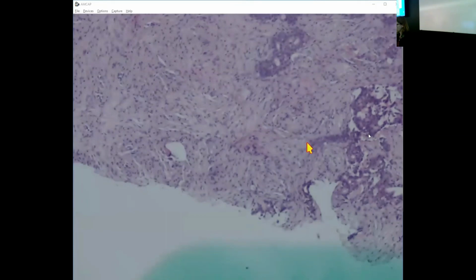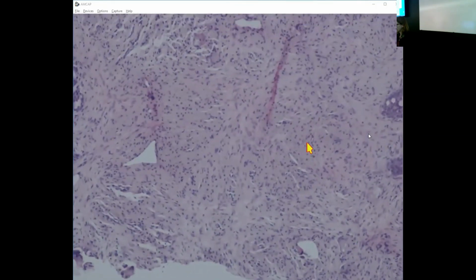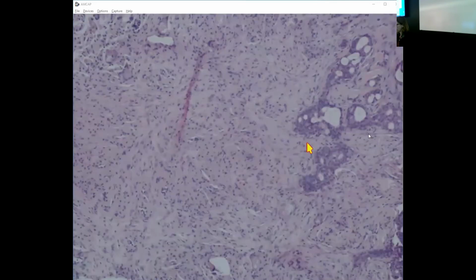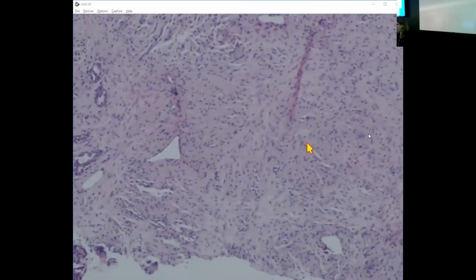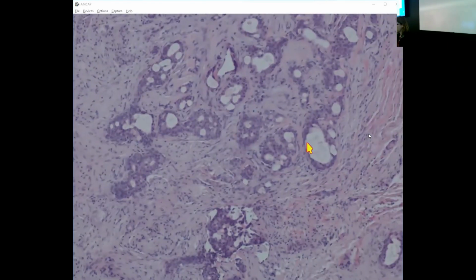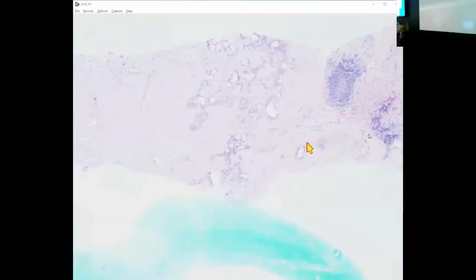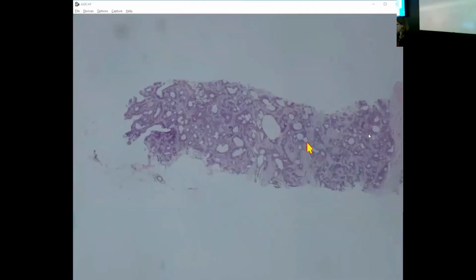It was almost histiocytoid, and it had giant cells in it. I don't know what was going on here because I'm not aware of it having been biopsied before. But again, the question here was whether this was invasive carcinoma because of these irregular nests. But this actually turned out to be an adenomyoepithelioma as well.